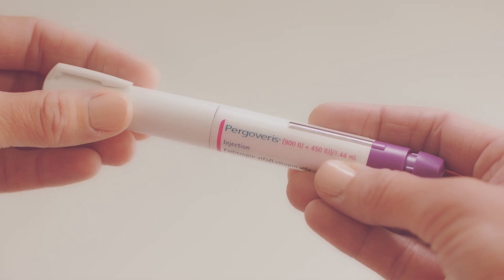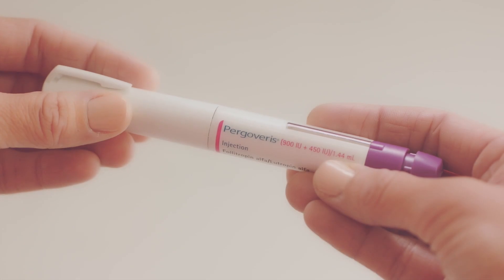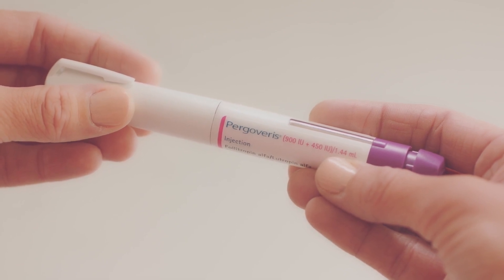Give yourself the injection at the same time every day. It's important to keep your pen in the fridge until the first time you use it. You can take it out half an hour before you want to inject to let it get to room temperature — that will make it a bit more comfortable when you inject. Check that your pen is at the strength you have been prescribed, as well as the expiry date on the pen and box, before using your Pergoveris pen.